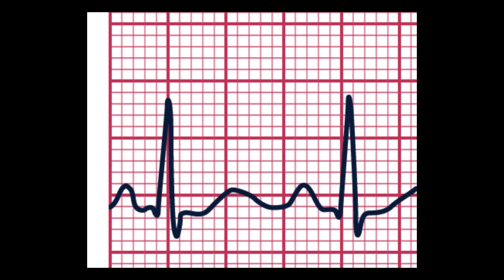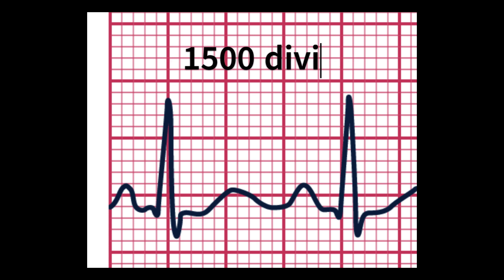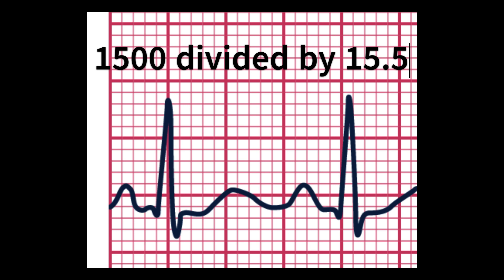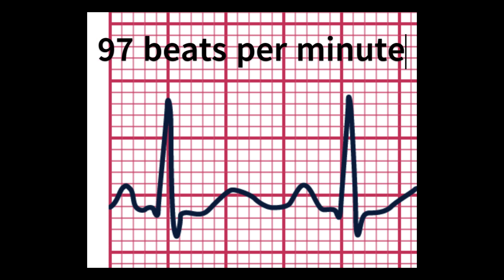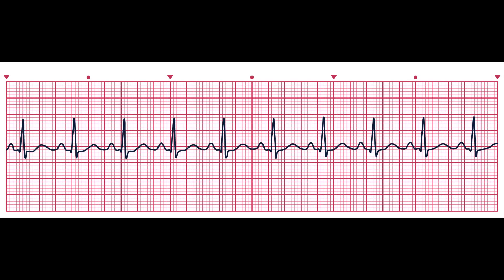We mark two successive QRS complexes as shown with arrows, then count the number of small boxes between them. To calculate the heart rate, we divide 1500 by the total number of small boxes between the two QRS complexes. In this example, 1500 divided by 15.5 gives a heart rate of approximately 96.8, rounded up to 97 beats per minute — close to the 100 BPM from the 300 method. Just like the 300 method, the 1500 method can only be used on regular rhythms.